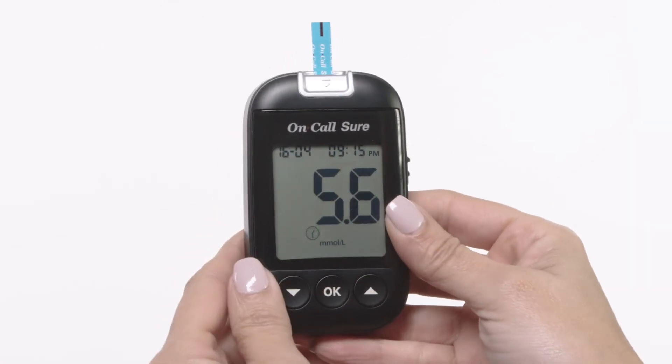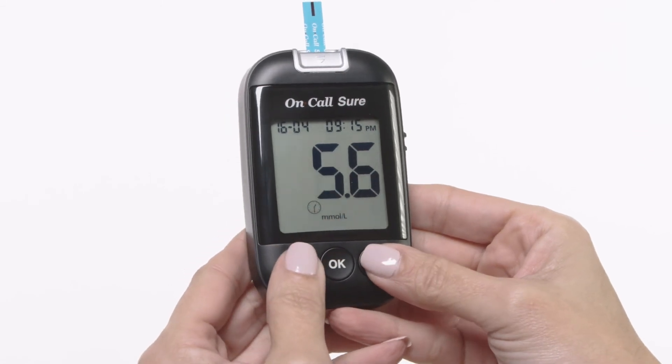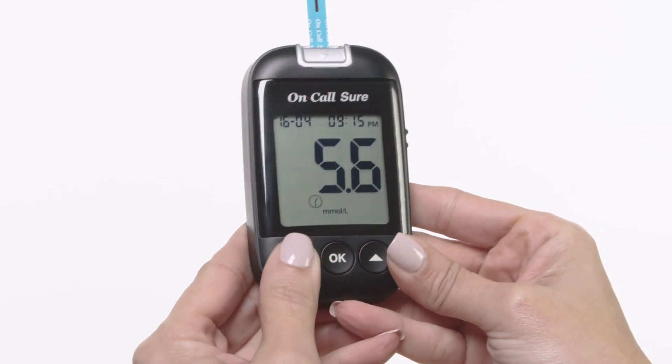Blood glucose results are automatically stored in the memory. To erase a reading, press the down and up button together. When a pound sign appears on the display, press the OK button.